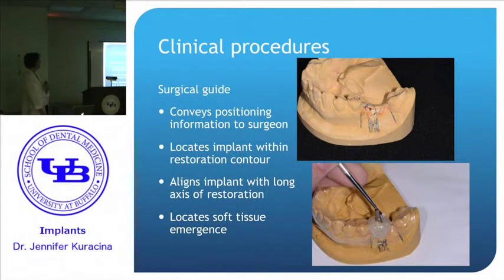We talk about surgical guides and the purpose of doing the diagnostic wax up and making the guide, allowing the surgeon to center the implant under the tooth. In a case like this where the space is wider than the tooth is going to be, you want to tell the surgeon where the diastema is going to end up. You want to center it for them.